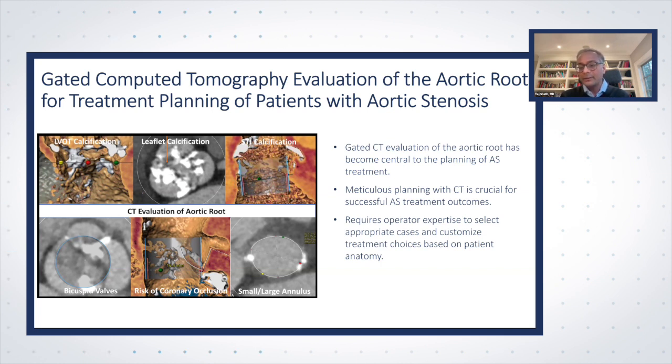This builds on that, in that what we're trying to do is say, okay, we do have a robust therapy of TAVR. We have an equally robust therapy of SAVR. What are some of the considerations beyond simply annular sizing that we can think about that will help us to dictate whether we do TAVR, SAVR, or even different valve types? So that's really the theme behind the review.